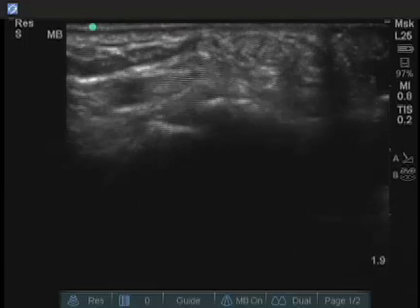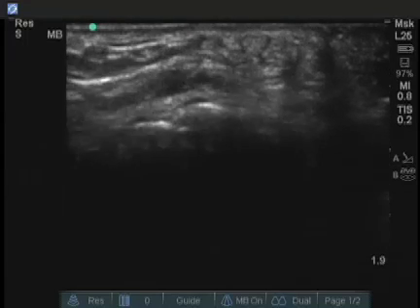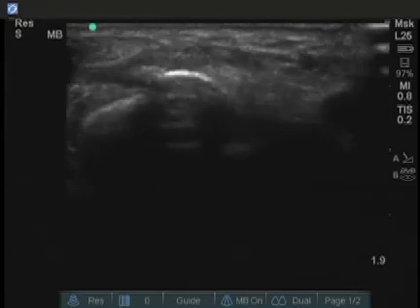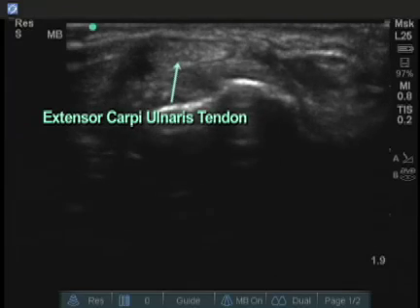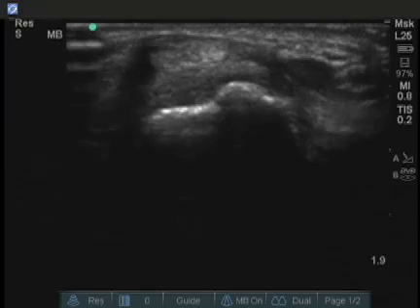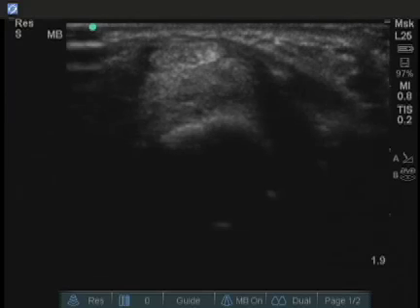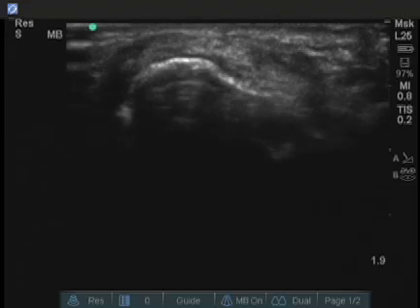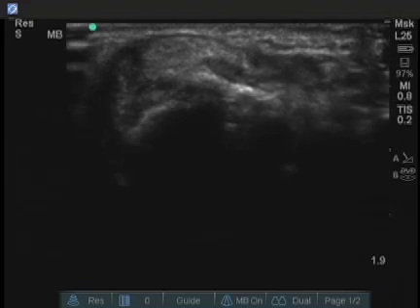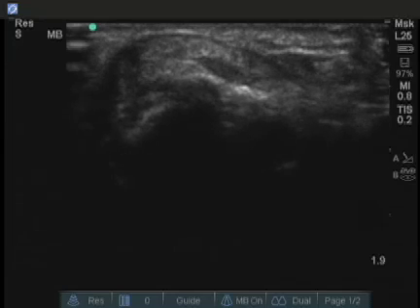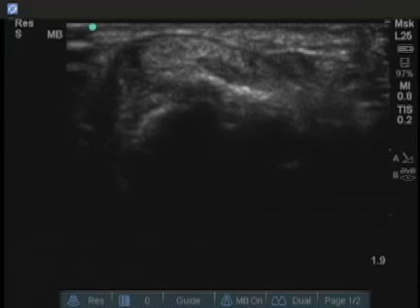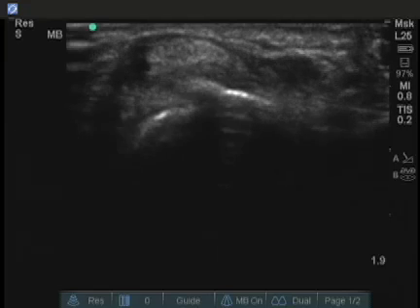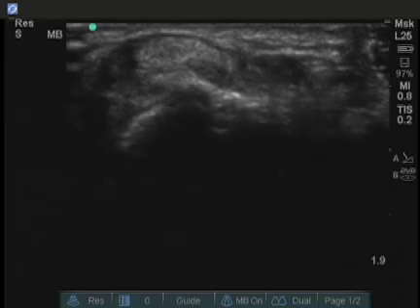This can then be traced distally out toward the thumb, and these tendons and their peritendinous tissue can be examined carefully. On the other side of the wrist toward the ulna, we have a very nice view of the extensor carpi ulnaris tendon, which is one of the largest extensor tendons in the wrist and easiest to see. It is frequently surrounded in a patient with an inflammatory process by fluid or synovium, seen as either anechoic or hypoechoic shadow around the distinct oval-shaped tendon.